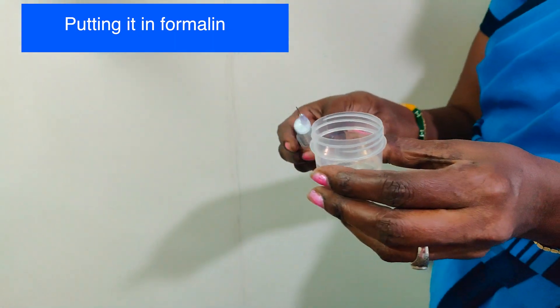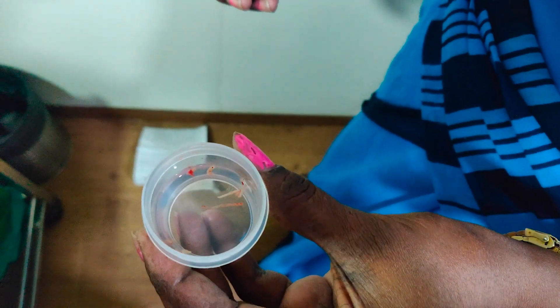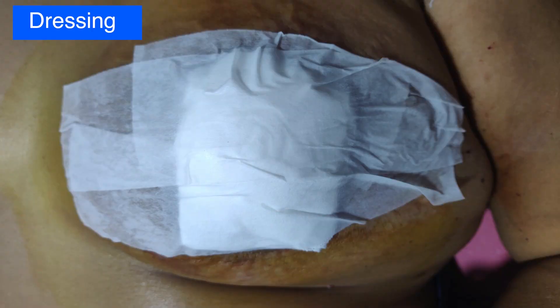Six to eight such specimens are collected, which is adequate for pathological analysis. The patient does not require any stitches. A simple dressing is given that can be removed a couple of days later.